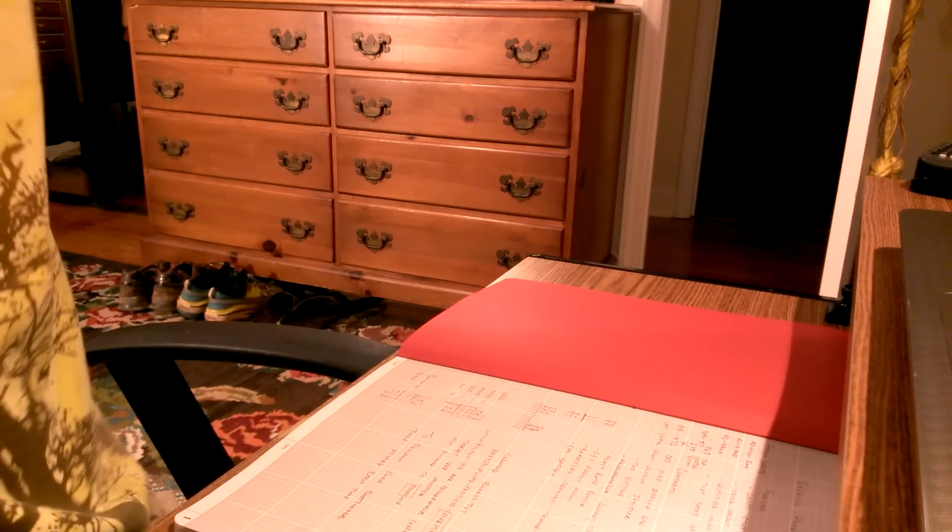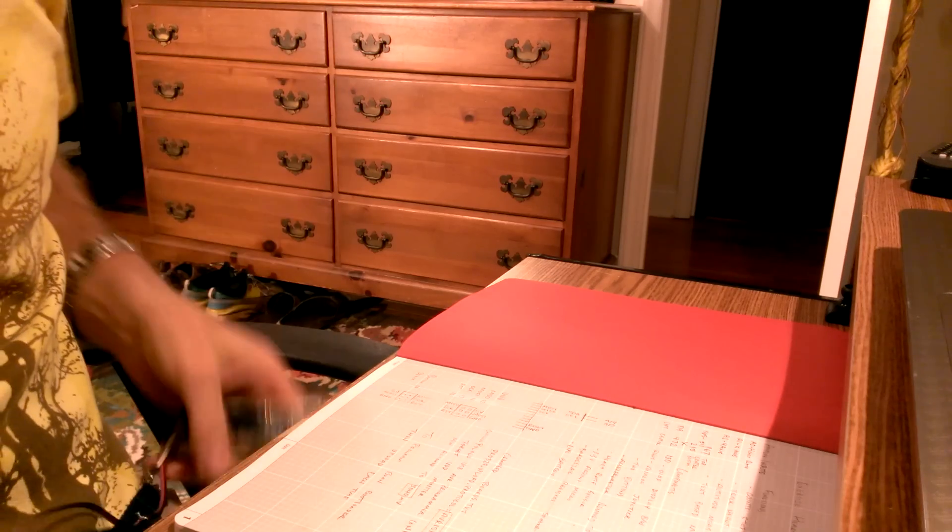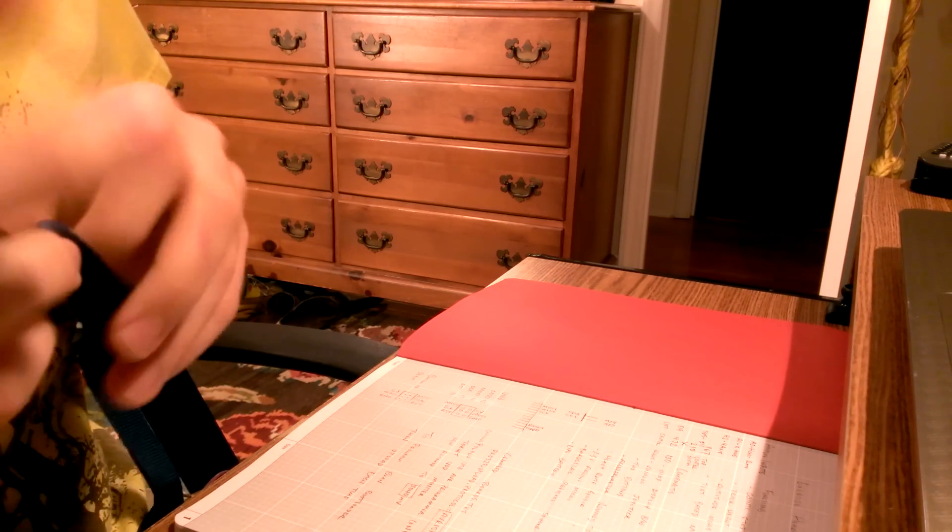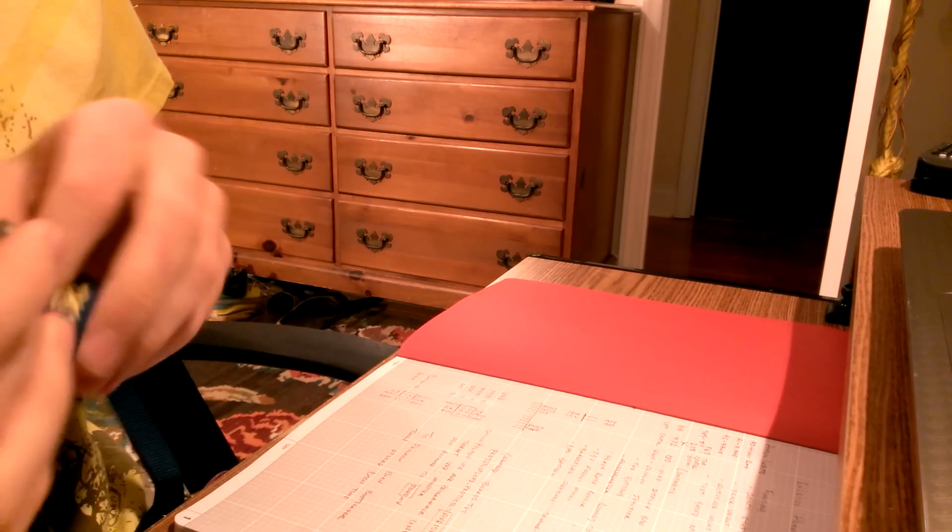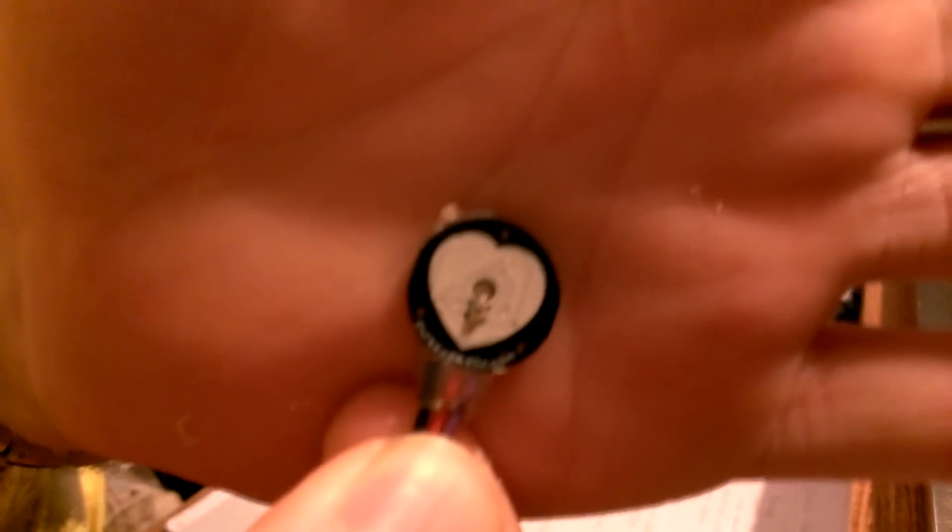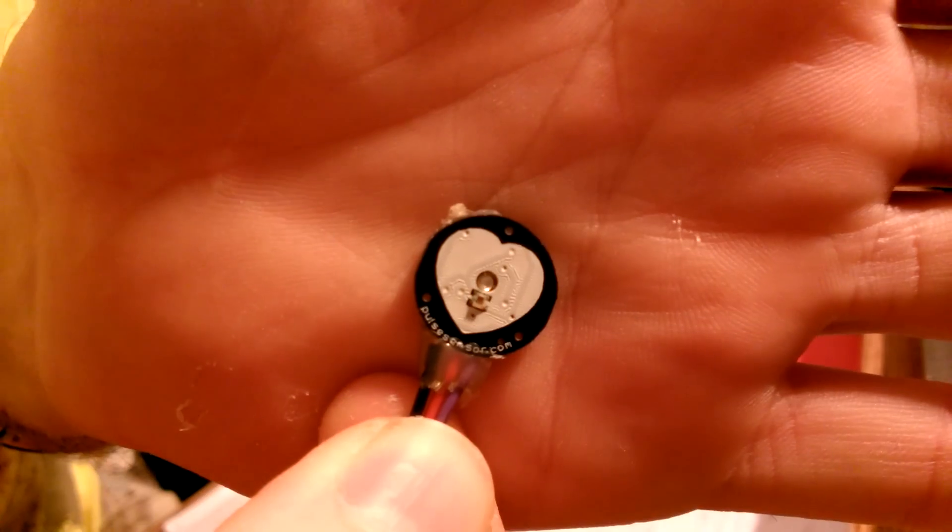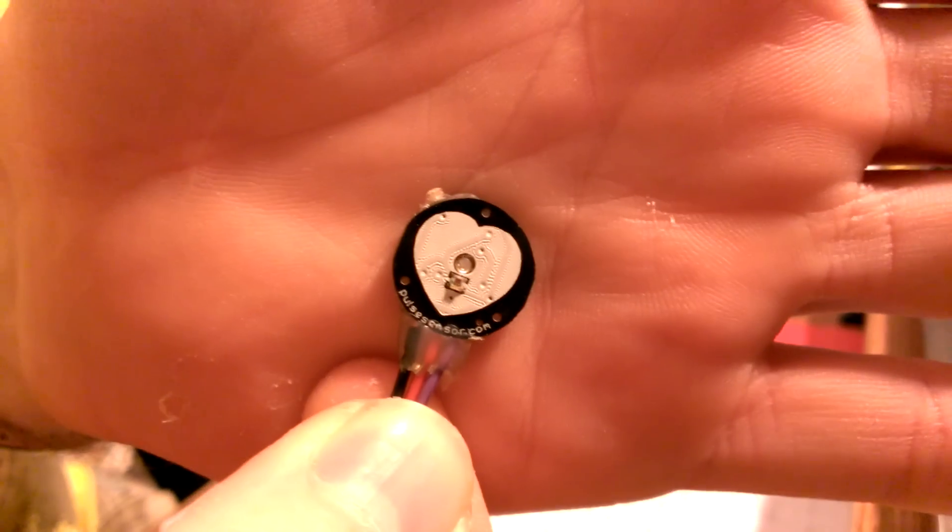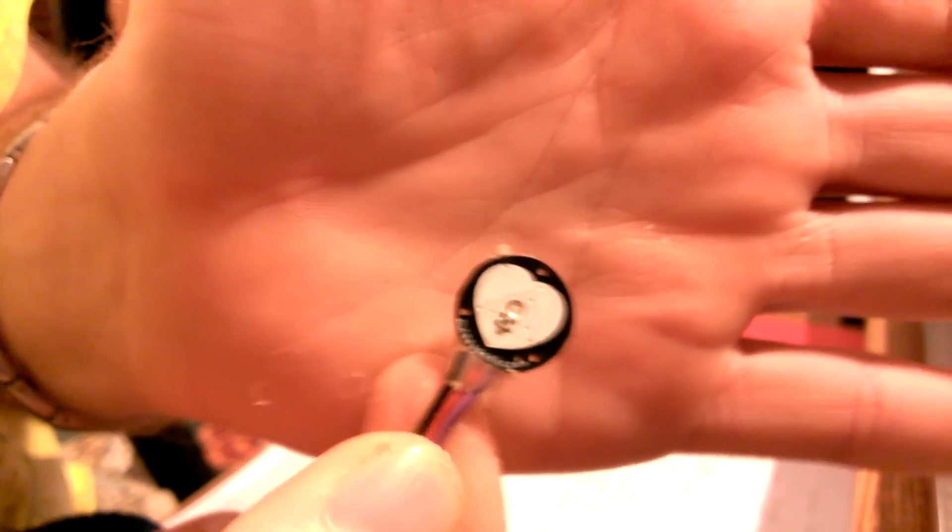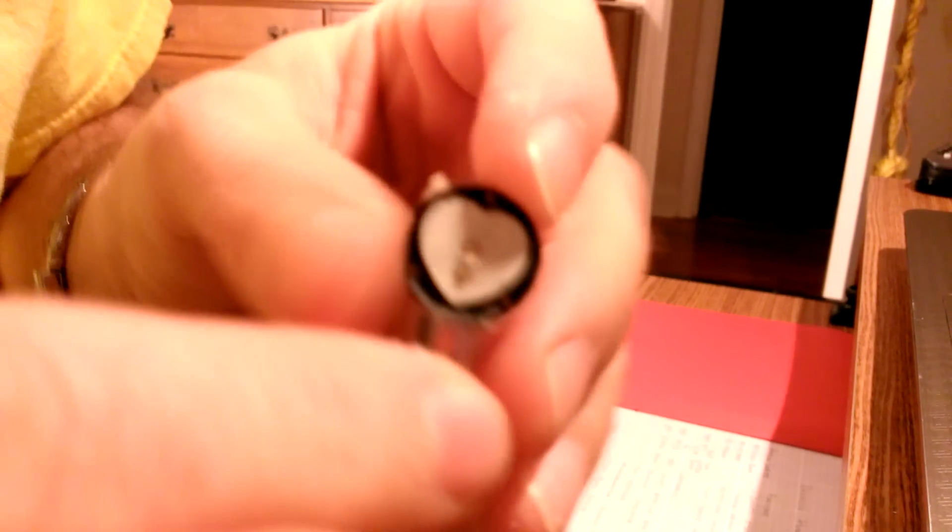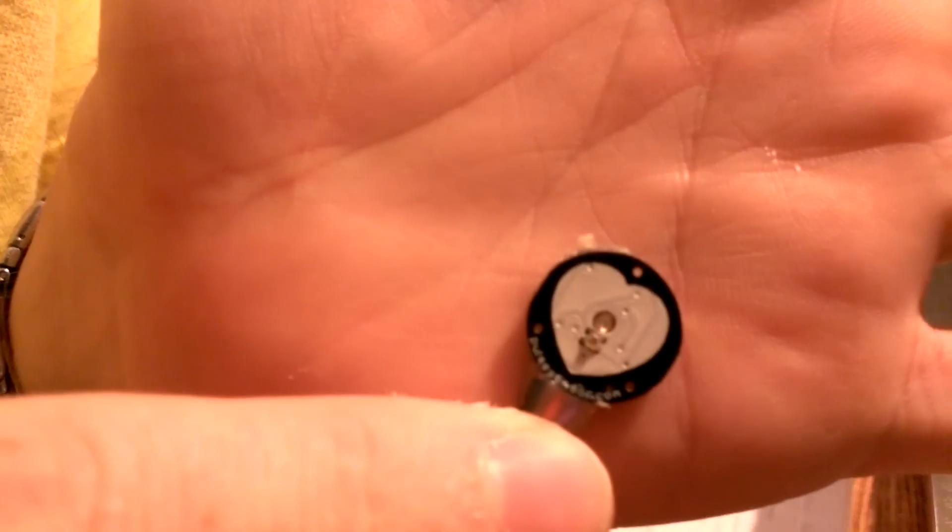I've always been kind of curious about my heart rate, and I found a heart rate sensor from SparkFun. Here's the sensor. This is a capillary heart rate sensor. You place it here anywhere on the skin, and a light shines out here into the skin.